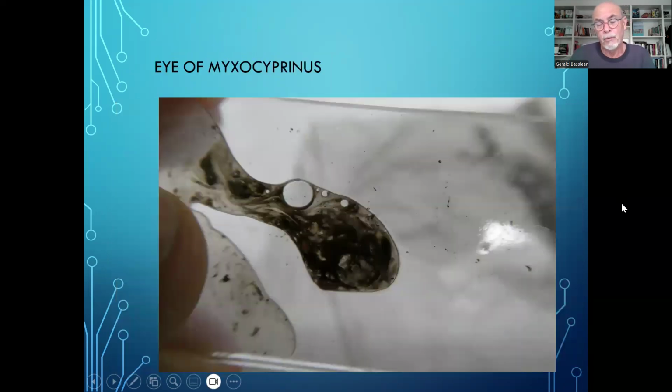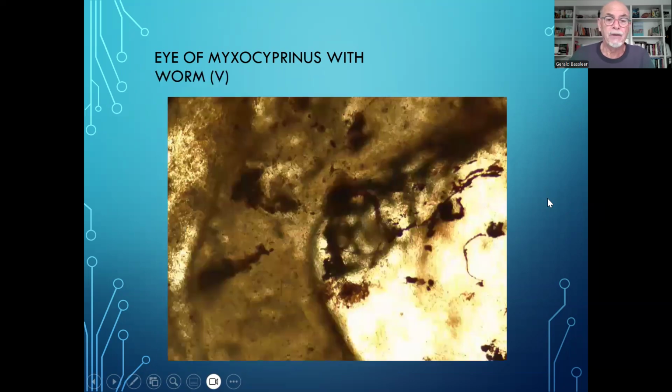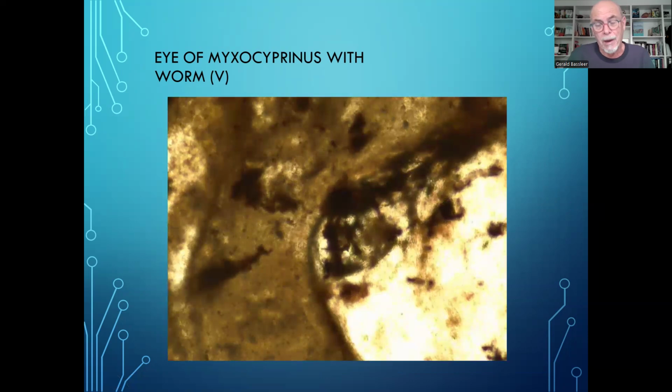And well, we took out one of the eyes and put it on a glass plate for the microscope. We saw a lot of things inside the eye, which needs examination with the microscope. We found lots of bacteria. Of course, you can imagine that when there is an infection, in a lot of cases bacteria is combined with other things that were happening in the eye.